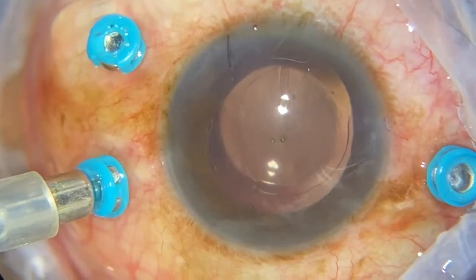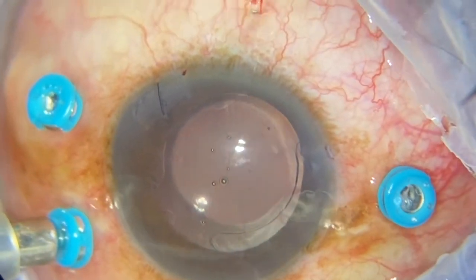I'm now marking the breaks with diathermy for easy identification. Putting a chandelier, although I have a very good assistant that does indentation. Here I'm looking for a small tiny break that I saw when I was doing the vitrectomy — I should have marked it immediately when I saw it. Also, whilst doing the indentation, I moved my indentation up and down to be able to expose the small tiny breaks that are covered with flap.